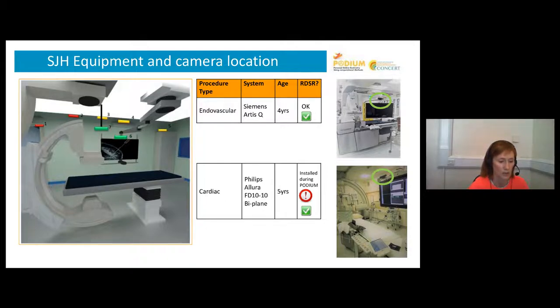But in our second room, which is the interventional cardiology room, it was a slightly older system. It had an RDSR capability, but it wasn't easy for us to access it. But we were able to get that installed, and the software capabilities to access the RDSR, as part of the PODIUM project.